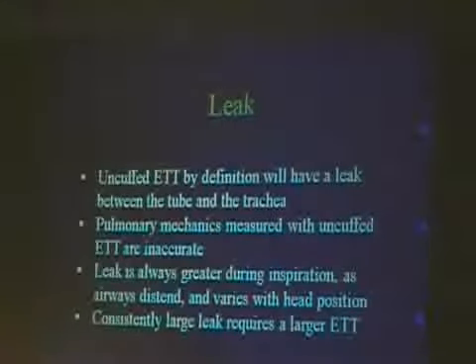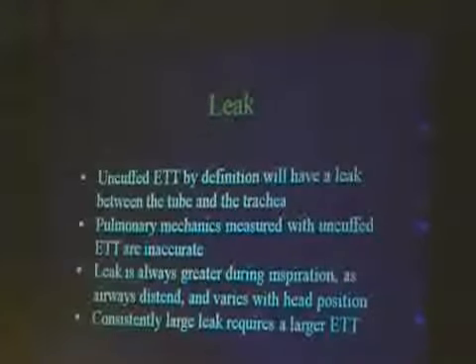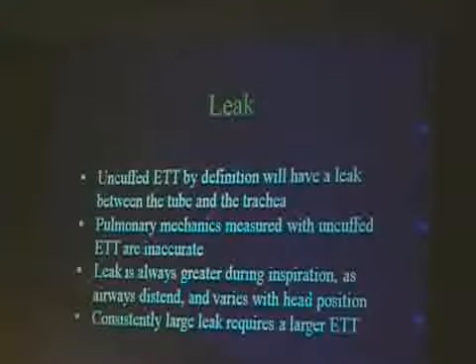So if you have a consistently large leak and you've adjusted the head position, remember it's like breathing through a little straw. You've got a big leak, you can't get it to go away, then you need a larger endotracheal tube. The trachea of the baby expands when the tube's been in for a long time. So it doesn't really matter the size of the baby, it matters the size of the trachea.